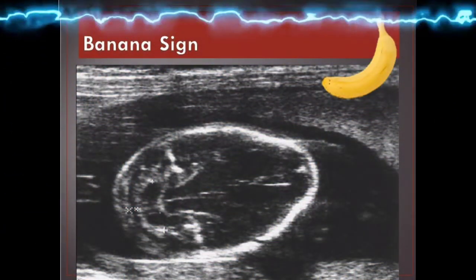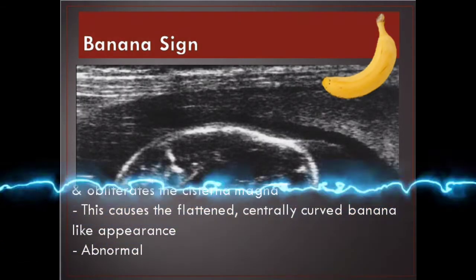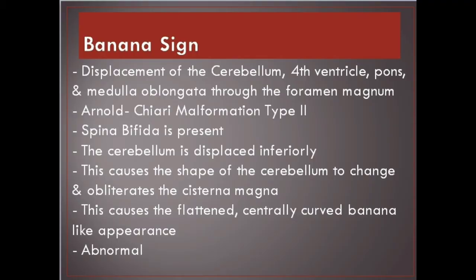Banana sign. Displacement of the cerebellum, 4th ventricle, pons, and medulla oblongata through the foramen magnum — Arnold Chiari malformation type 2. Spina bifida is present. The cerebellum is displaced inferiorly, causing its shape to change and obliterating the cisterna magna. This produces the flattened, centrally curved banana-like appearance. Abnormal.